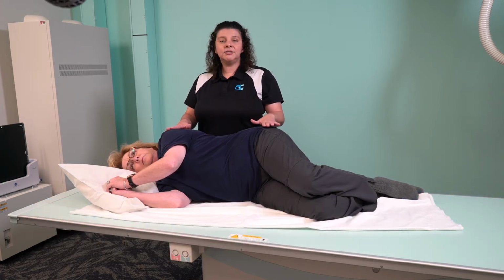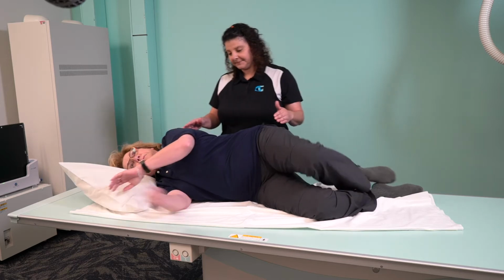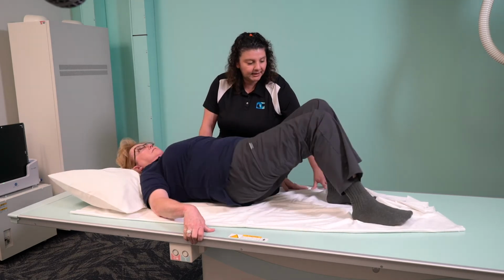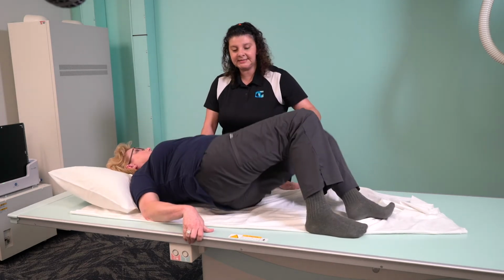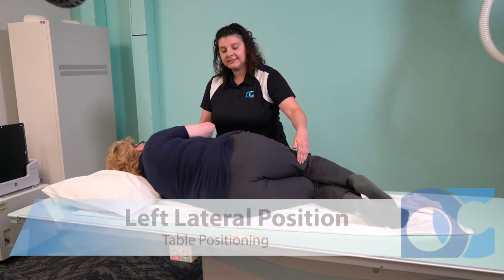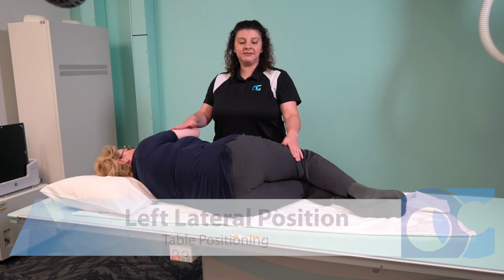If I needed her to lay on her left side, let's have you lay onto your left side. She's going to be facing me. And again, when you have patients, go ahead and assist them, guide them. This is a left lateral position because she's laying on her left side.